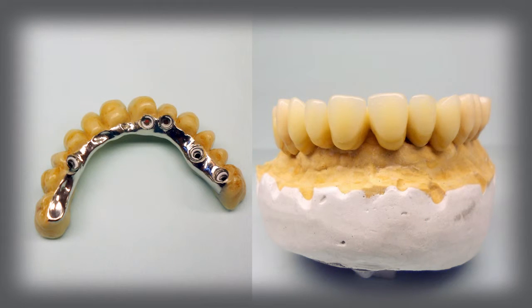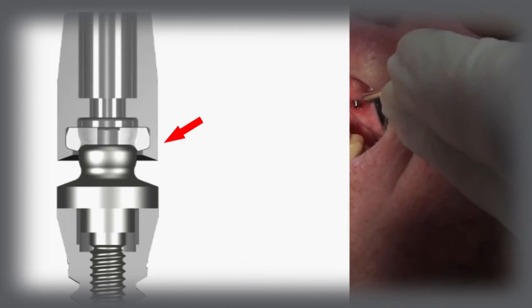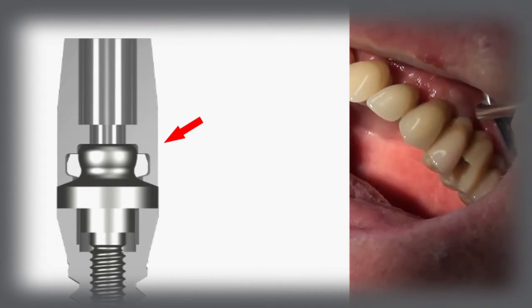During the insertion of the prosthesis on the model or in the patient's mouth, the cylindrical titanium abutments with Seegers inside meet the hemispheres of the OT equator attachments that, being slightly rounded at the top, receive the pressure of the bridge and favor the entrance of the Seegers.